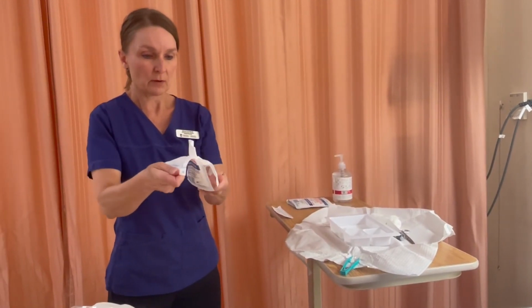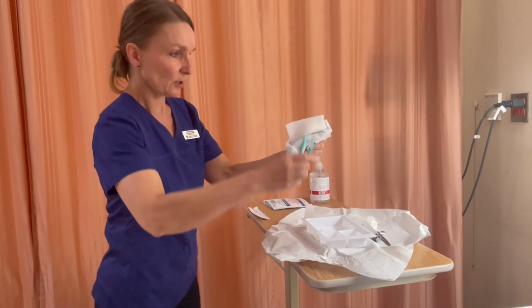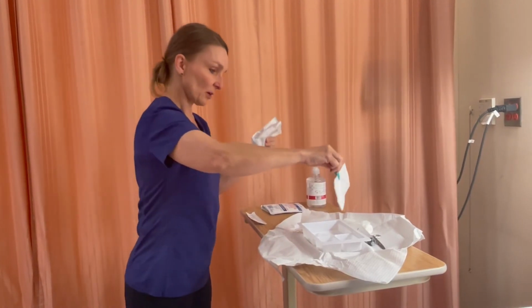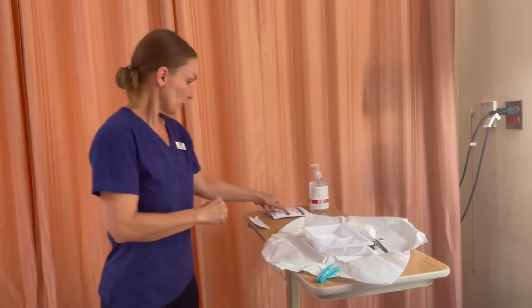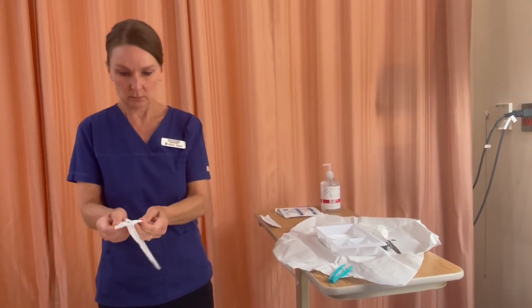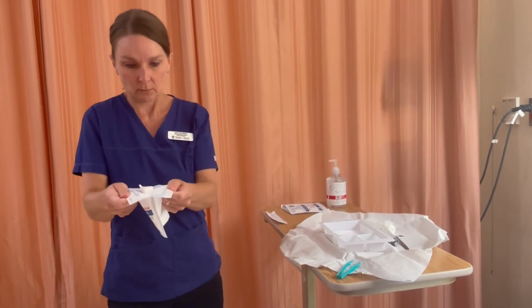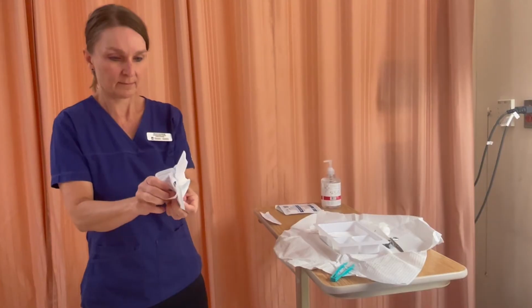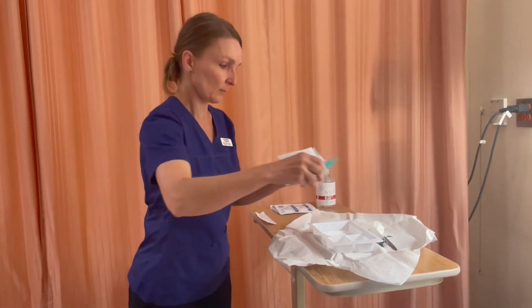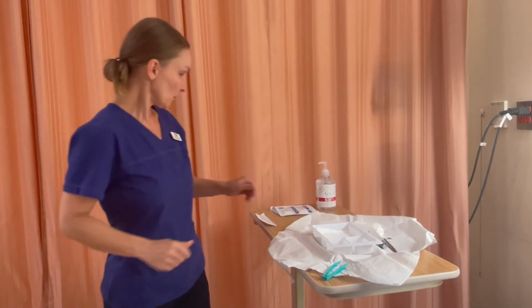Now, do you see how I'm opening the sticky portion and then winging back? This prevents you from having the packaging flip back. I'll put it right in the tray there. And I feel that that is enough supplies.